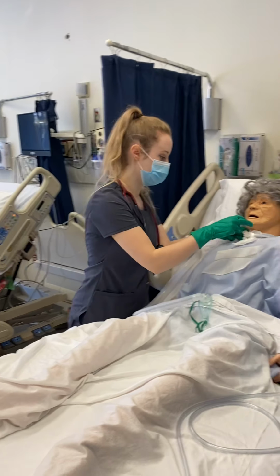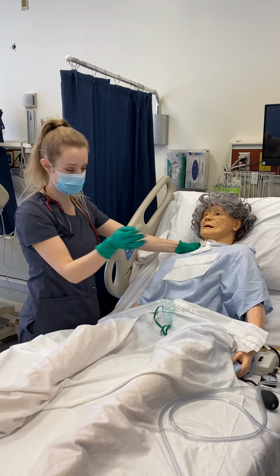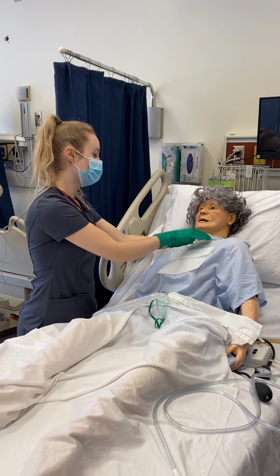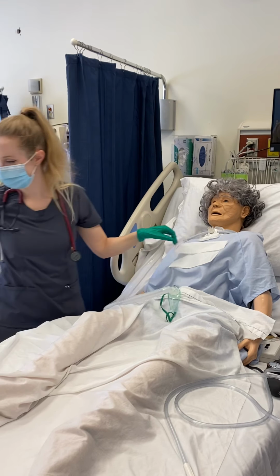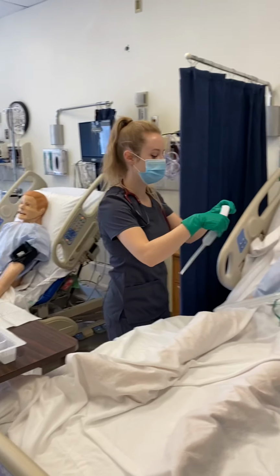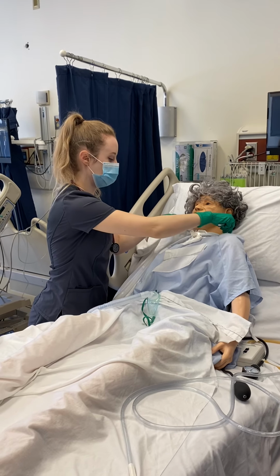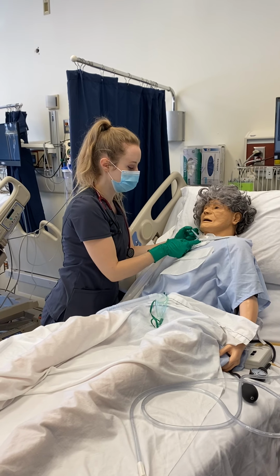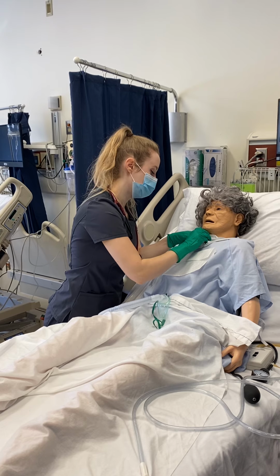And then my last step is that I typically would have a partner here to help me hold one side. For the sake of this video, I'll be doing it by myself. I will remove the trach collar and place a new trach collar on. I'll go ahead and put this around back so I have minimal time with it not being connected. I'll detach one side at a time.